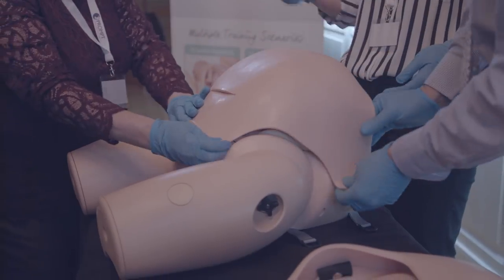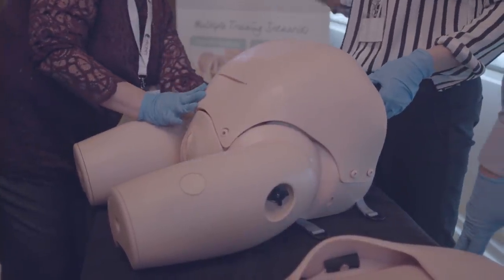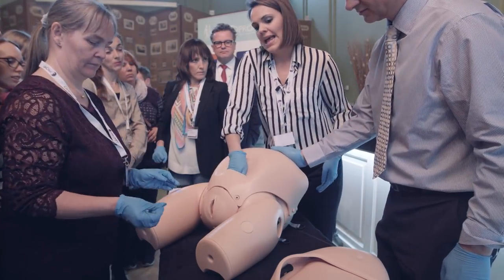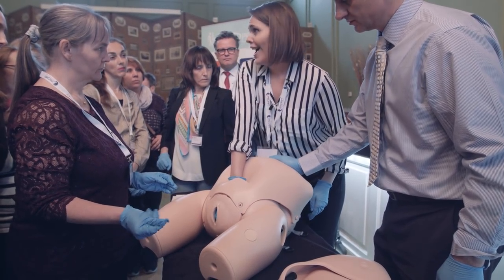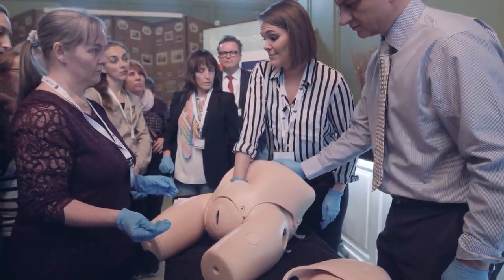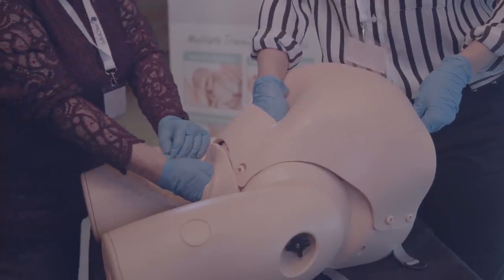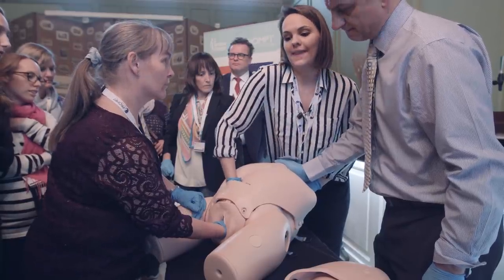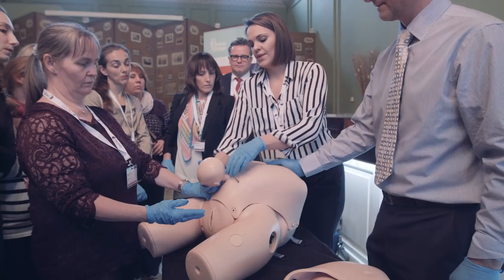Obviously this is not where you'd be standing for your cesarean delivery, so I apologize. First of all, it's always good to have a little bit of lubrication. It's really difficult to deliver the head — at a push I could probably just about flex and disimpact it, but I'm going to ask Mary to do a push-up from below. Okay, and I can feel that releases that kind of vacuum that you get, and then that allows me to deliver the head.